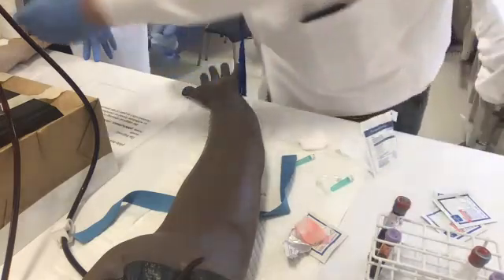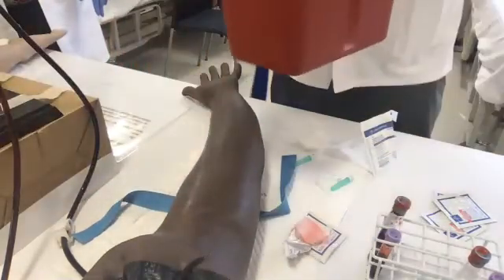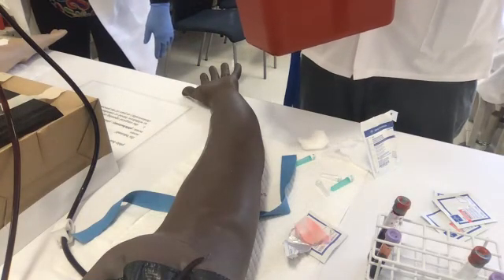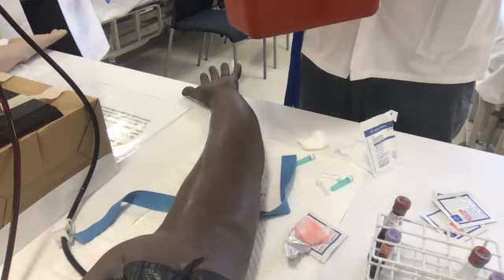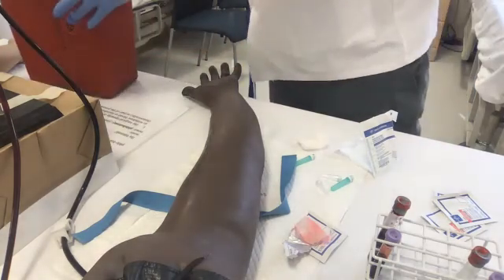Now I have this. If you guys notice, you see this key thing here? Looks like a little key. Do you guys ever wonder what that thing was for? You break it off, don't you? No, you don't break it. You just put it here, right? And then you do lefty-loosey. No. And then, doop.